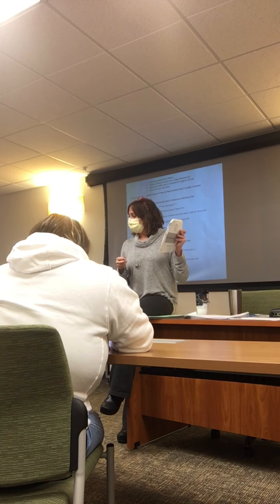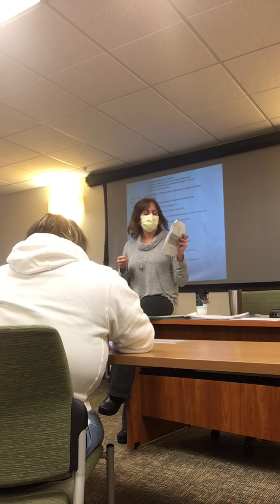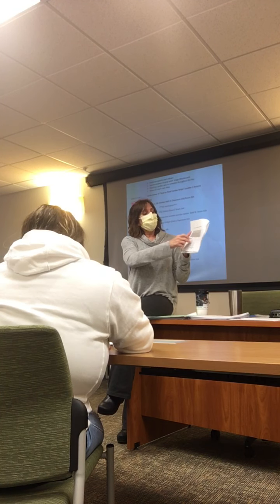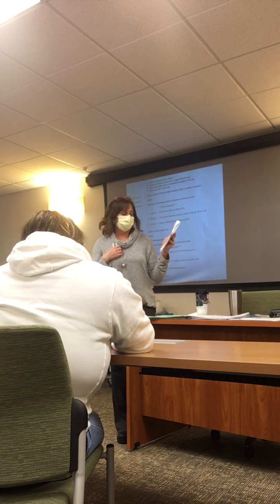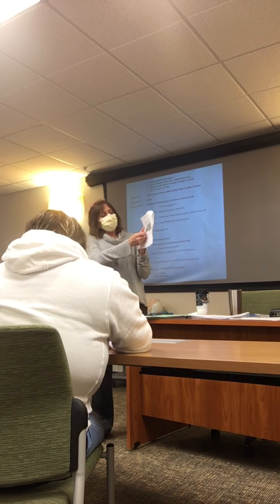What is the rate? How do I know the rate? I count the number of R waves in a 6-second strip, right? So what are you getting? 60. With this, I would want to see if they're perfusing with it. I'd feel if they had a pulse and listen if they had an apical pulse with this. So when I'm looking at this rhythm, this is premature.